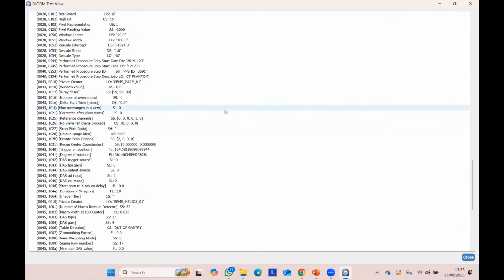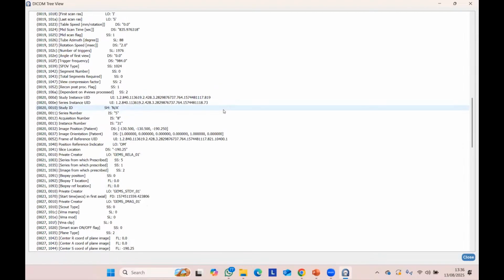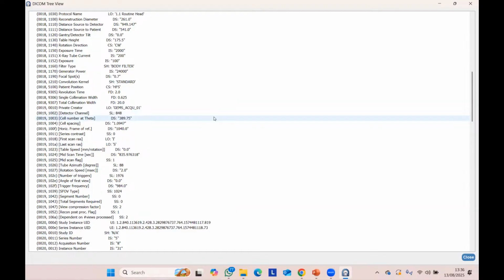As already mentioned, even though DICOM is standardized, sometimes the information is not similar. It is the problem. Sometimes one DICOM has specific information, but another DICOM has none. So if we develop software for many vendors, it is the problem. Yeah. Okay.